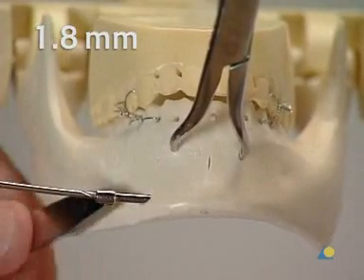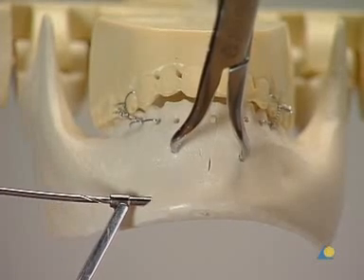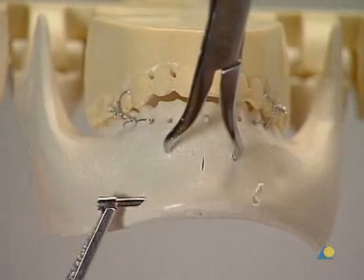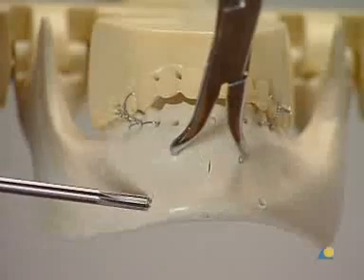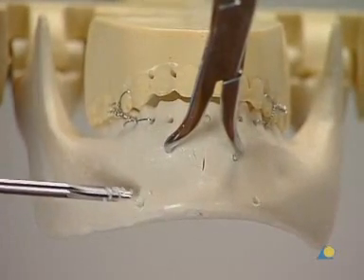Then, using a long 1.8 mm drill bit, drilling is continued through the far cortex. Counter-sinking is done by hand, taking care not to counter-sink too deeply to avoid removing the cortical bone buttress.